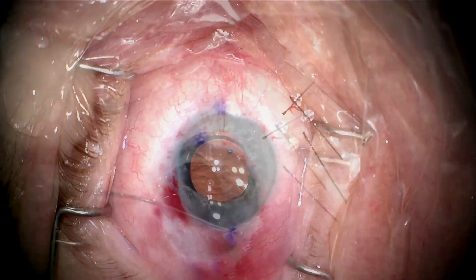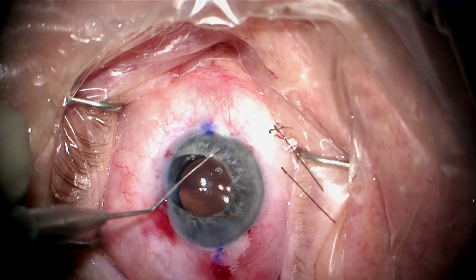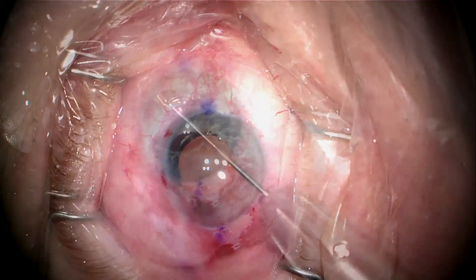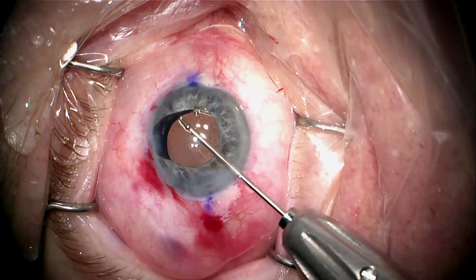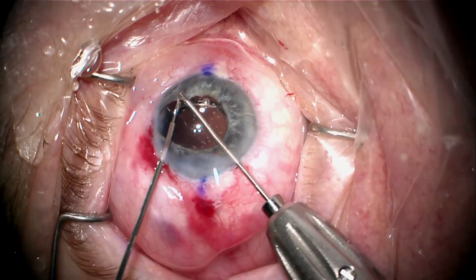We remove the iris hooks and place miochol, trying to bring the pupil down as much as possible by stroking it. But it really doesn't come down that much. So here we're placing viscoelastic, and I'm stretching the iris to see what I've got to work with.